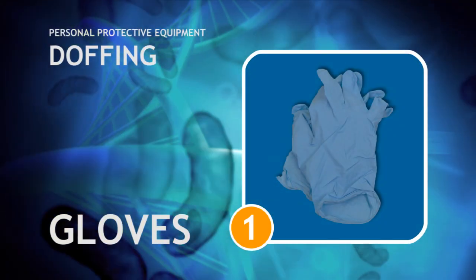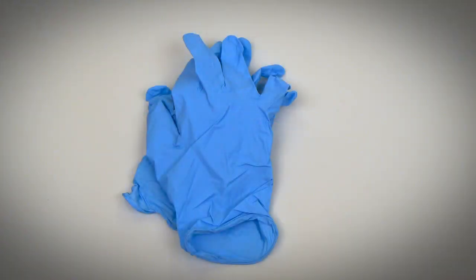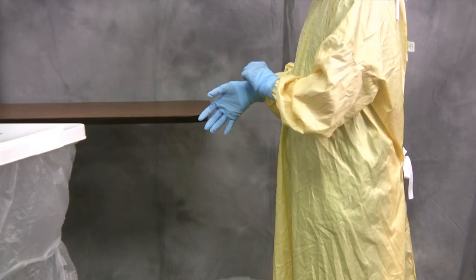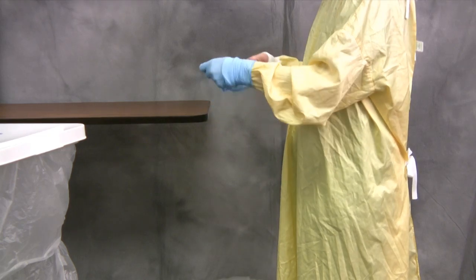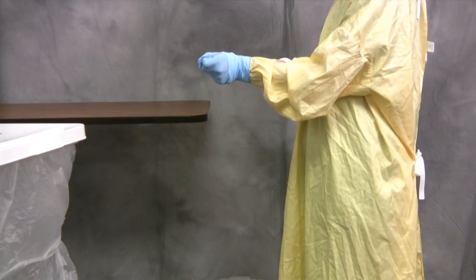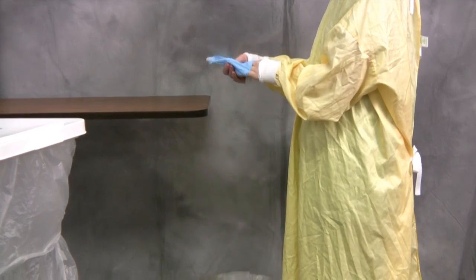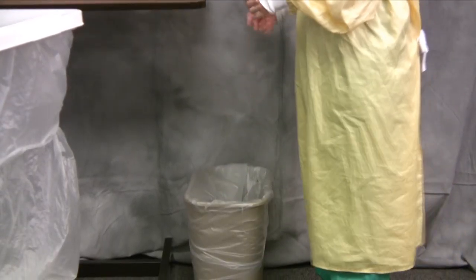The first step in the procedure to remove personal protective equipment is doffing the gloves. Gloves are removed first because they are likely the dirtiest item and are contaminated on the external surfaces. Grasp the first glove on the external surface at the cuff and gently peel off. Hold the removed glove in the gloved hand, then slide a finger of the ungloved hand under the remaining glove, touching its clean side only, and gently peel the second glove off over the first. Discard the gloves in the trash.